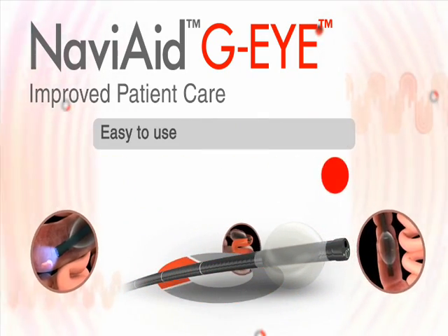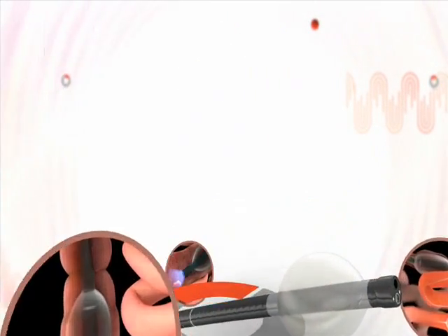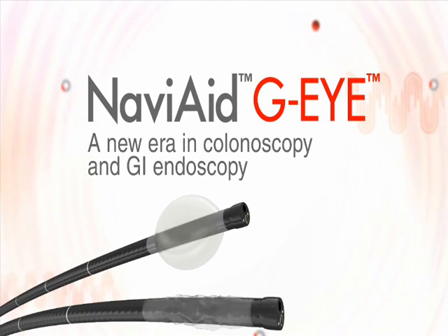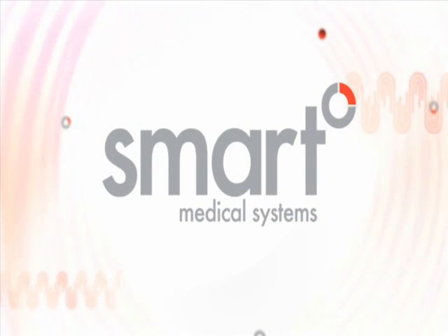It is simple to learn and use and is compatible with all endoscopy brands. Navi-Aid GI — a new era in colonoscopy and GI endoscopy. By Smart Medical Systems, endoscopy the smart way.